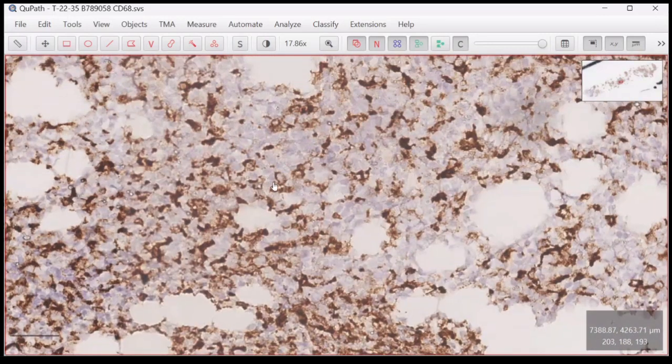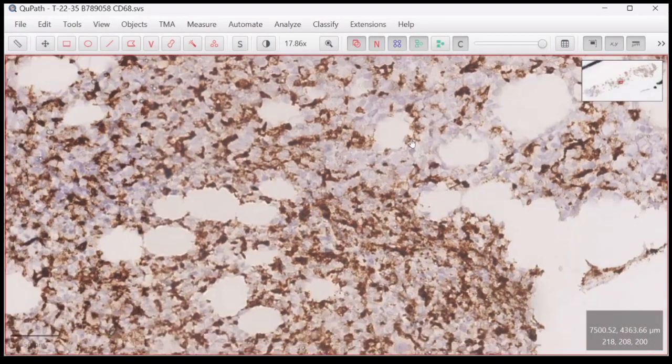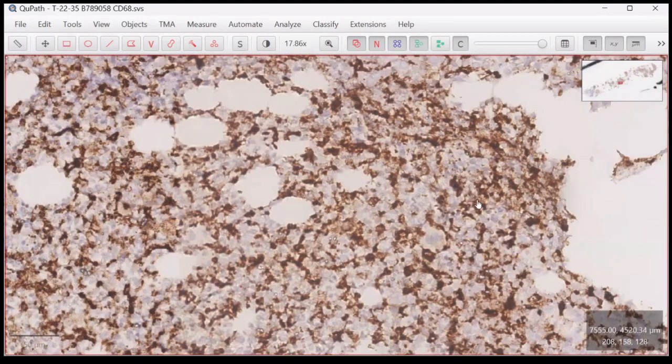Here, just focus on those cells with intact cytoplasm, not the reticular dendritic cells here. Just focus on this cell. Some cells, the larger cells, are expressing CD68 as well. So now we check on CD34 and CD117.